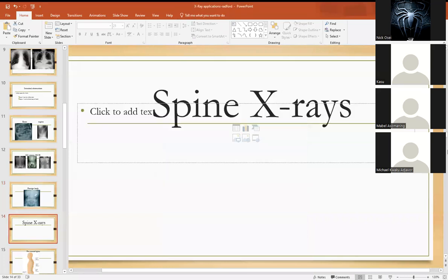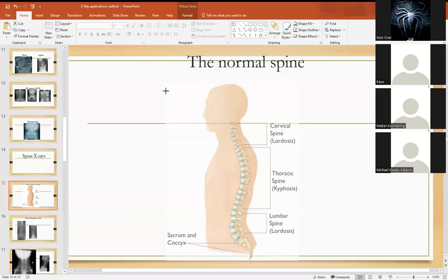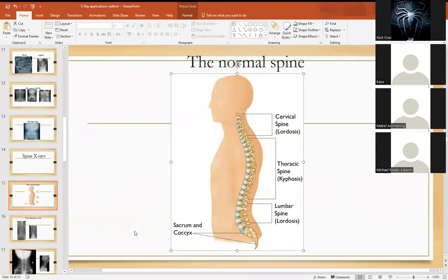Moving on to spine X-rays. For spine X-rays, you need to know a bit of anatomy first. The spine is divided into the cervical spine, thoracic spine, lumbar spine, and the sacral region. The cervical spine has a normal lordosis — it is curved forward. The thoracic spine is curved backward, which is a normal kyphosis. The lumbar spine also has lordosis. Bending forward of the spine is lordosis; bending backward is kyphosis. At various points this curvature may be normal.